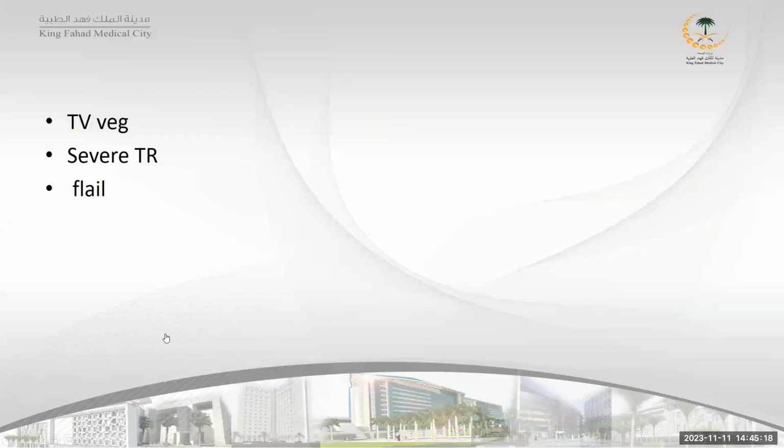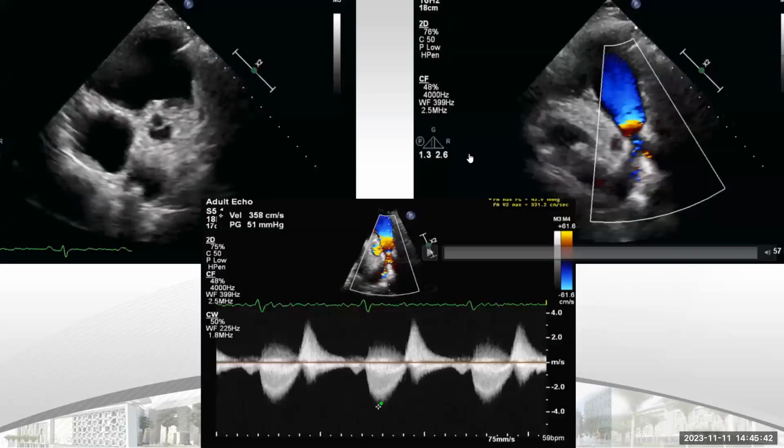So once you have vegetation, you have to write if you have another complication. You may have abscess, perforation of the leaflets, paravalvular leak, pseudoaneurysm or aneurysm, fistula. All of these are complications that may happen along with vegetation, and they may bring this case to you. So please take care about this. Next.